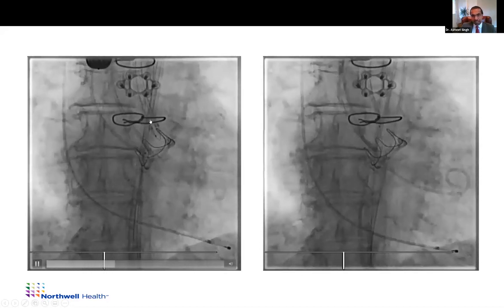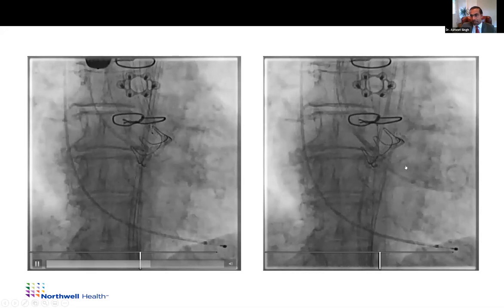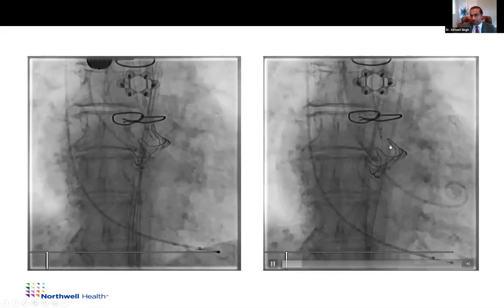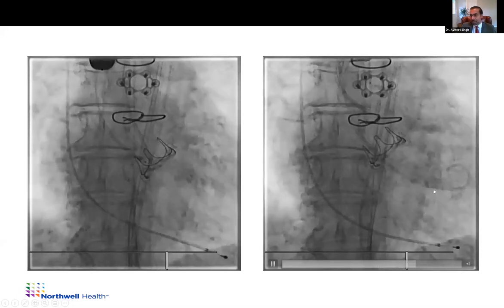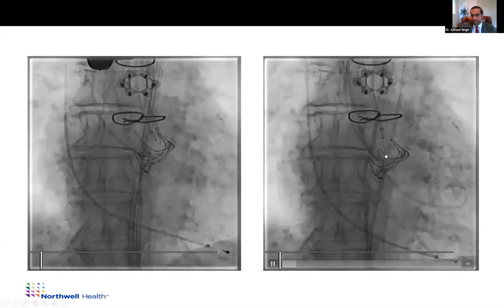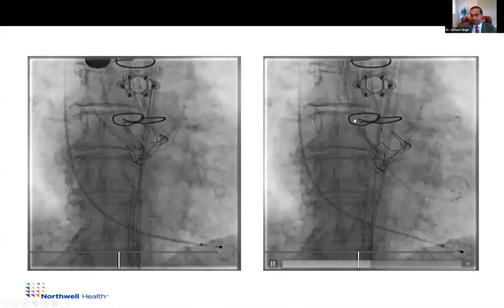You lacerate the left leaflet. We had a pigtail part before we lacerated the right leaflet, only because if there is any hemodynamic compromise, you have access to the valve and you can quickly deploy your TAVR valve, and then we lacerated the right leaflet.